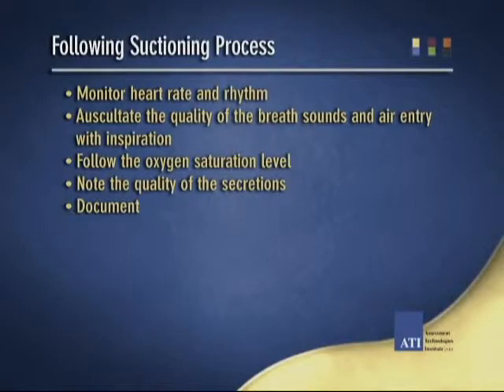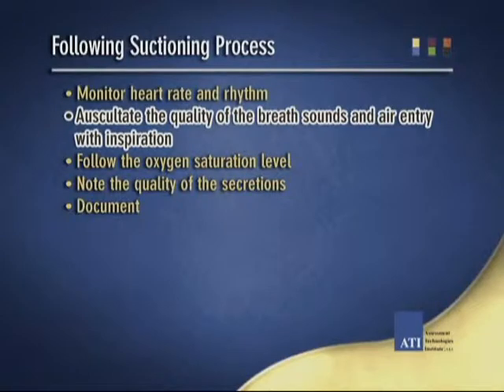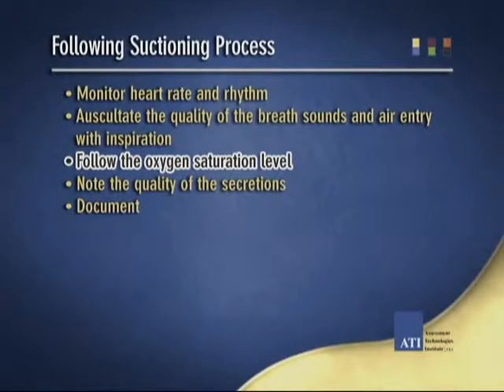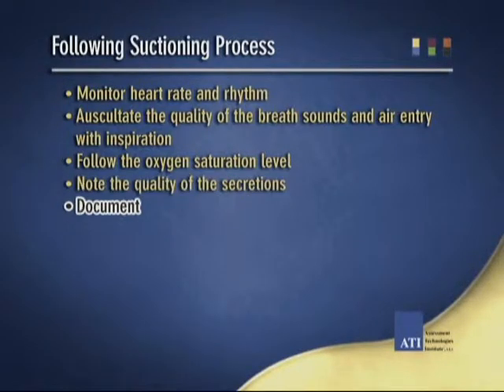Once the suctioning process has been completed, and during suctioning as well, monitor the client's heart rate and rhythm, auscultate the lungs again, and follow the oxygen saturation level. Note the quality of the secretions, color, thickness, odor, and amount, and document in the client's record.